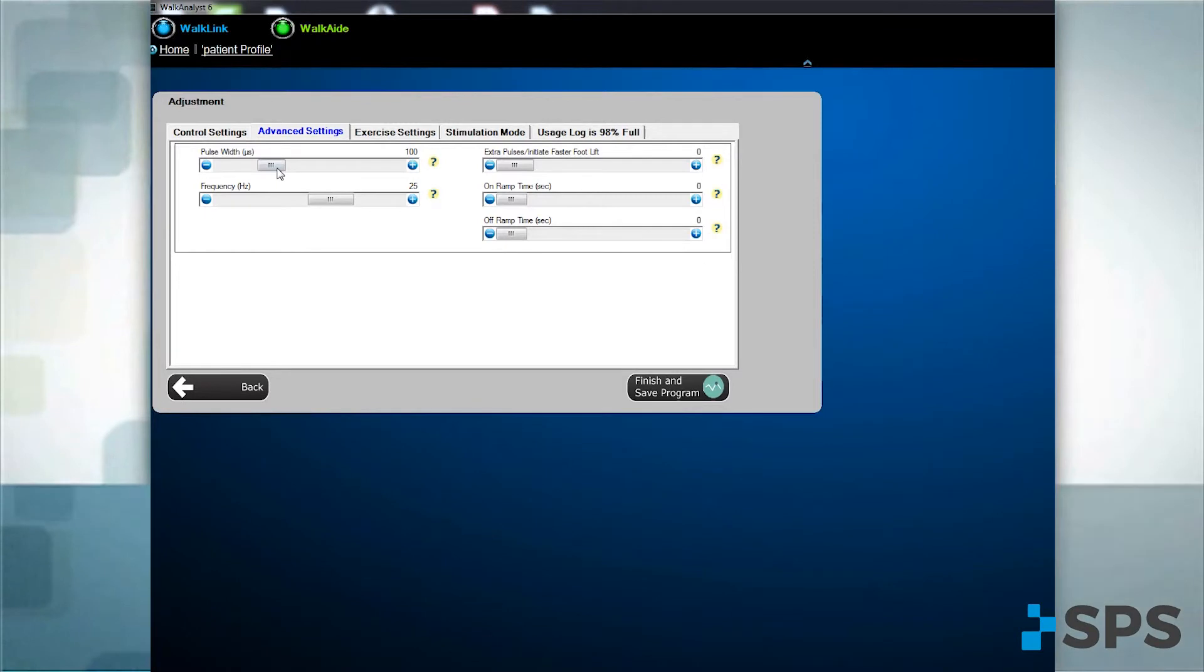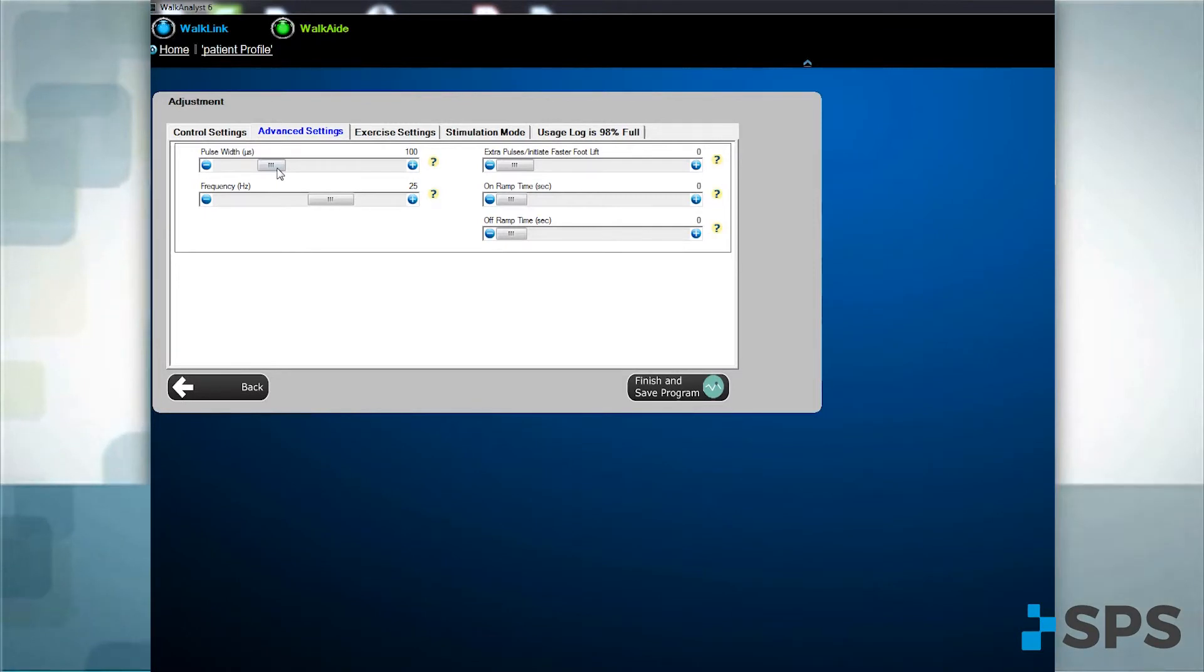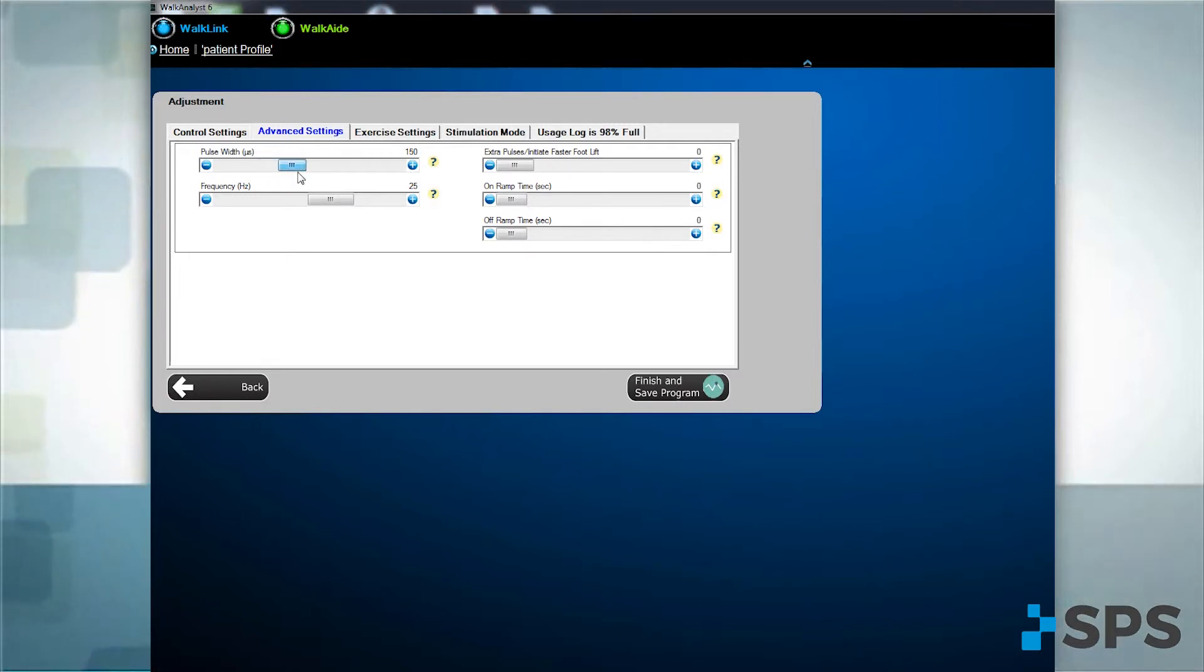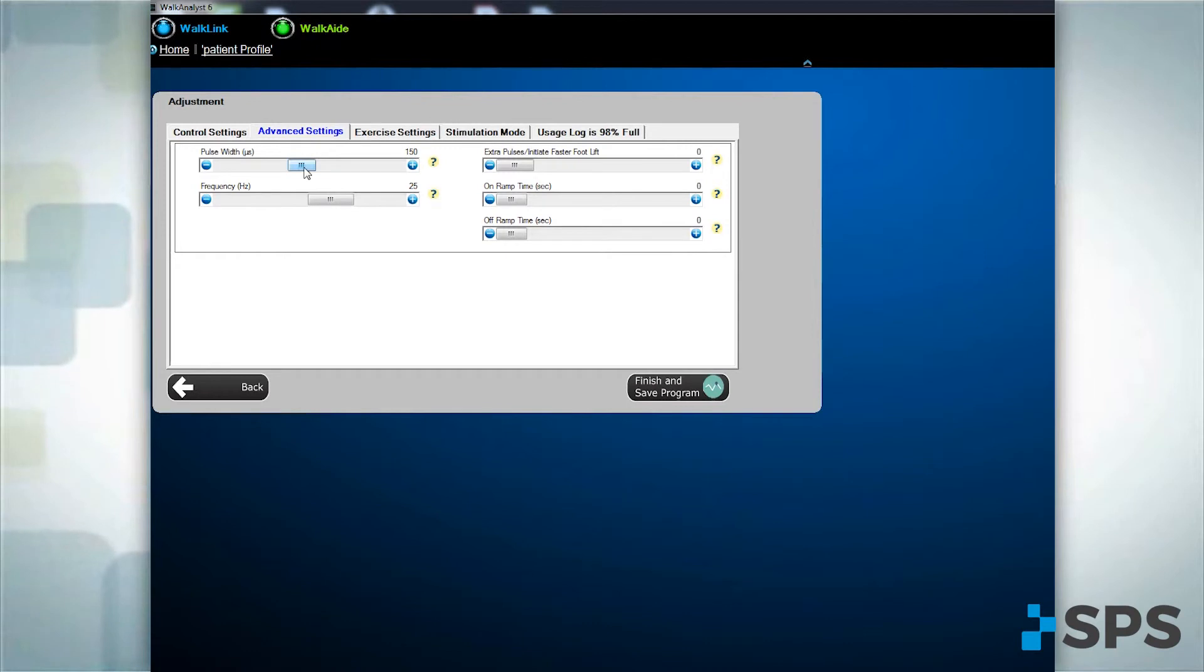The advanced setting tab lists the stimulation parameters which can be adjusted to improve comfort and function. Increase the pulse width for a more forceful contraction. For example, large limb, limited response.